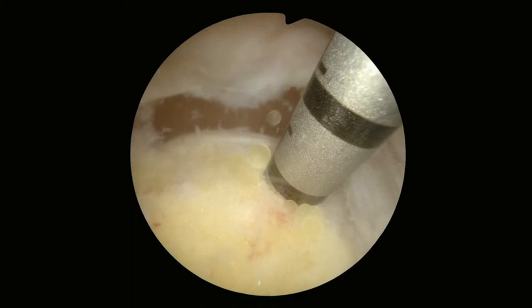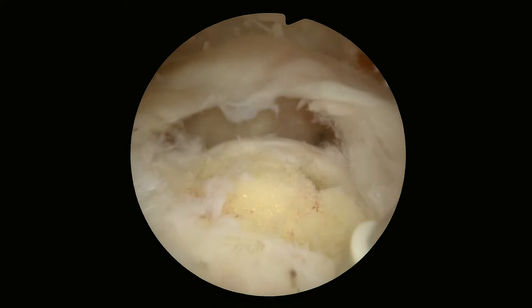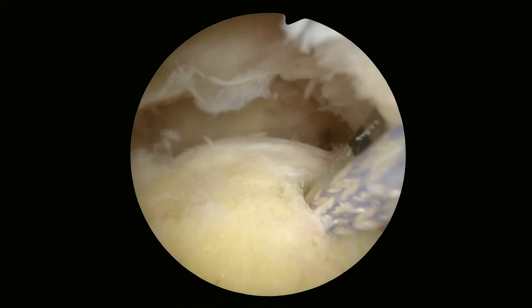We're going to put anchors medially. These anchors are like drywall screws — they go in and we use them to attach the sutures to the bone. Then we pass the sutures around the rotator cuff and pull it back down to where it's supposed to be.